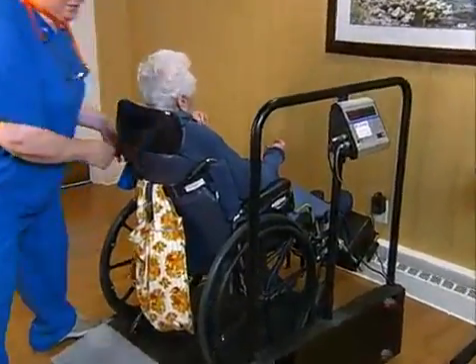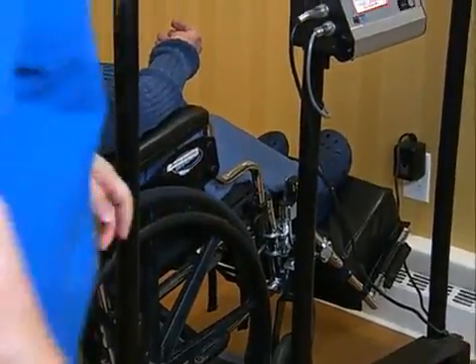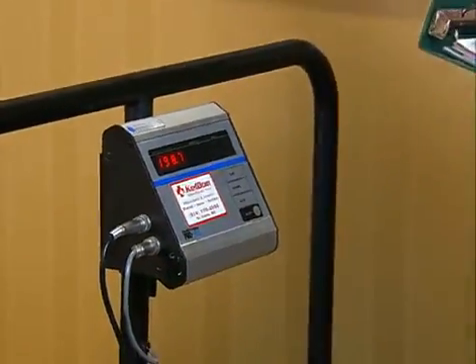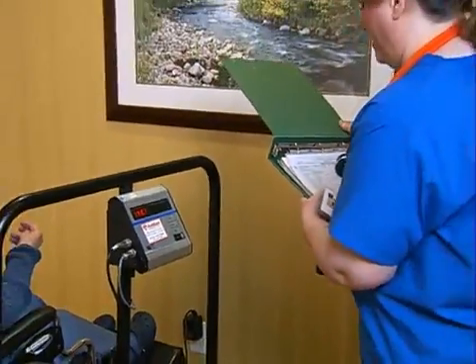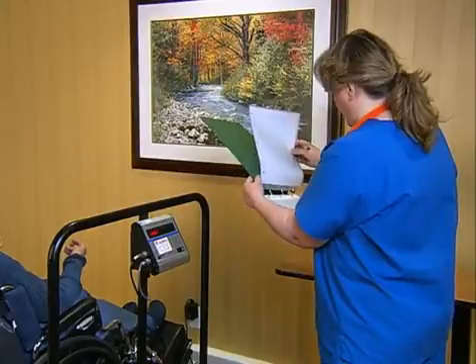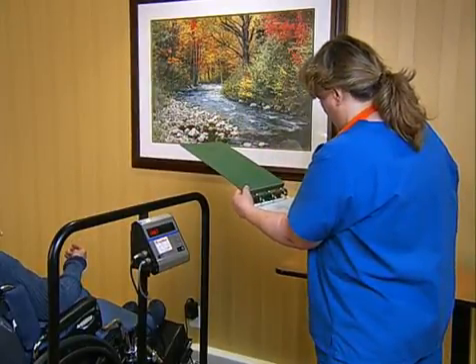Remember to first establish the weight of the chair, cushions, accessories or oxygen equipment before evaluating weight. Then deduct the weight of the chair, cushions, accessories or oxygen equipment from the total weight before recording the patient's weight in the medical record. Watch for the digital display to provide a reading.